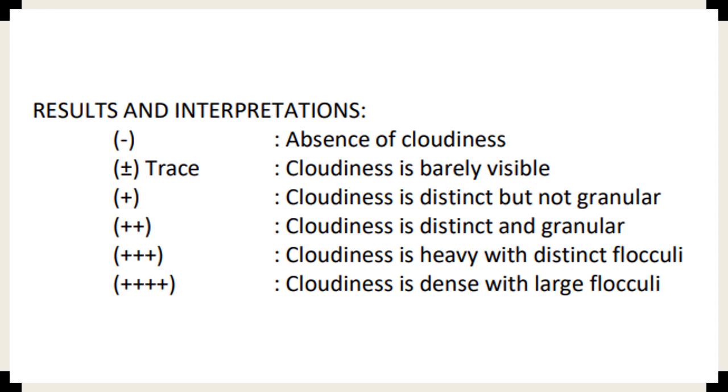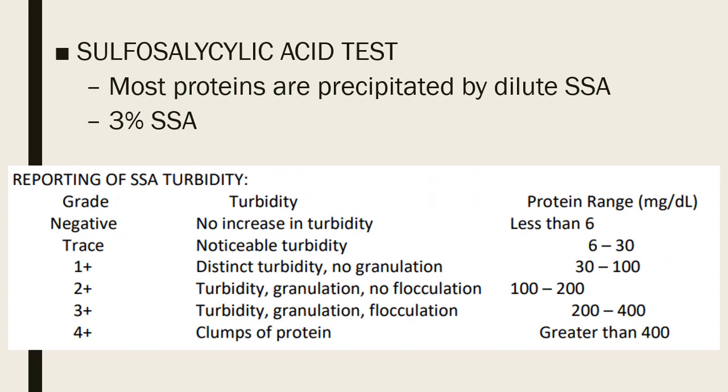So that is again a test for your albumin, the heat and acetic acid test. This one is accordingly the reference method. And then you have your SSA, sulfosalicylic acid.